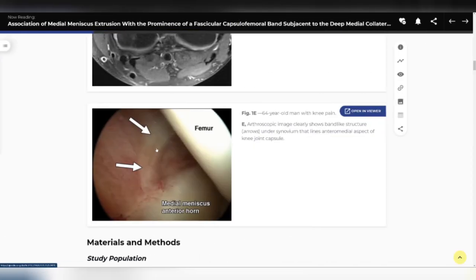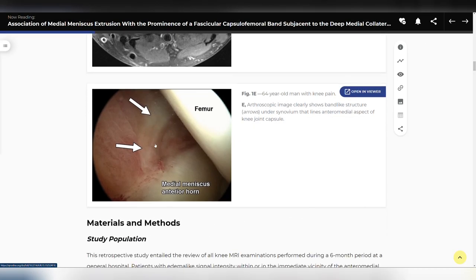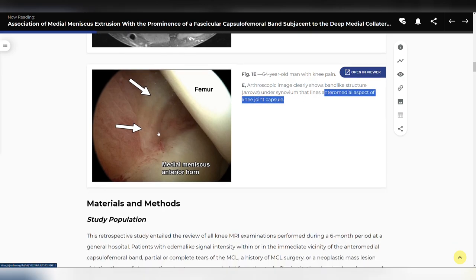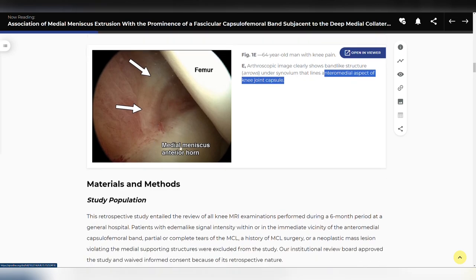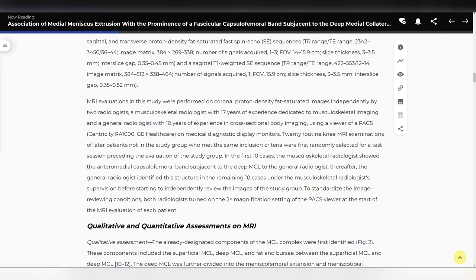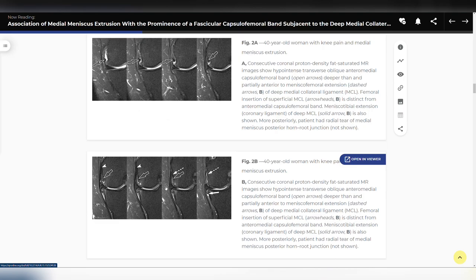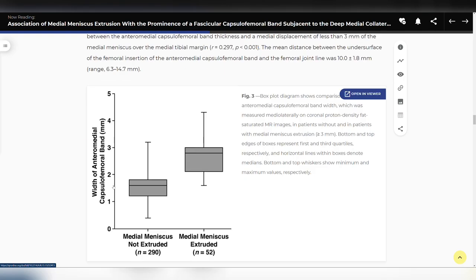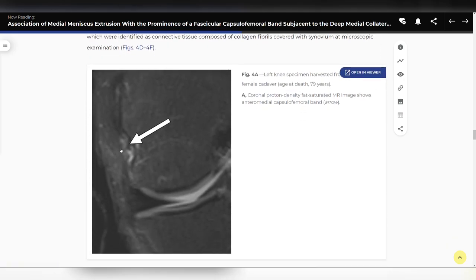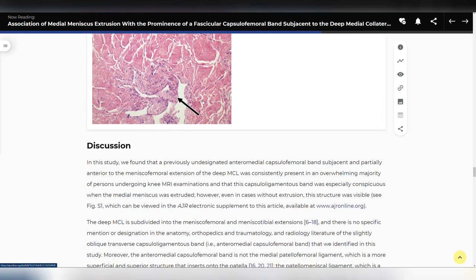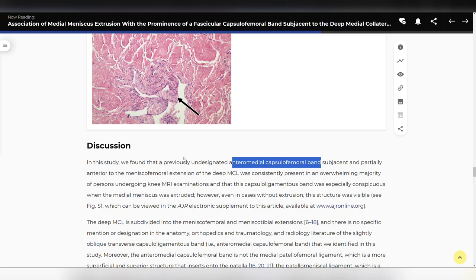In arthroscopy, this appears as a nodular cord-like structure in the anteromedial aspect of the knee joint capsule — technically part of the joint capsule but fascicular, thickened, and blending into the anterior horn of the medial meniscus. There seems to be an association with meniscus extrusion, as if the band plays a role in stabilizing the meniscus. It can measure two to three millimeters even without extrusion, though it is statistically thicker with an extruded meniscus. They also reviewed this from a histopathology standpoint; they call it the anteromedial capsulofemoral band.